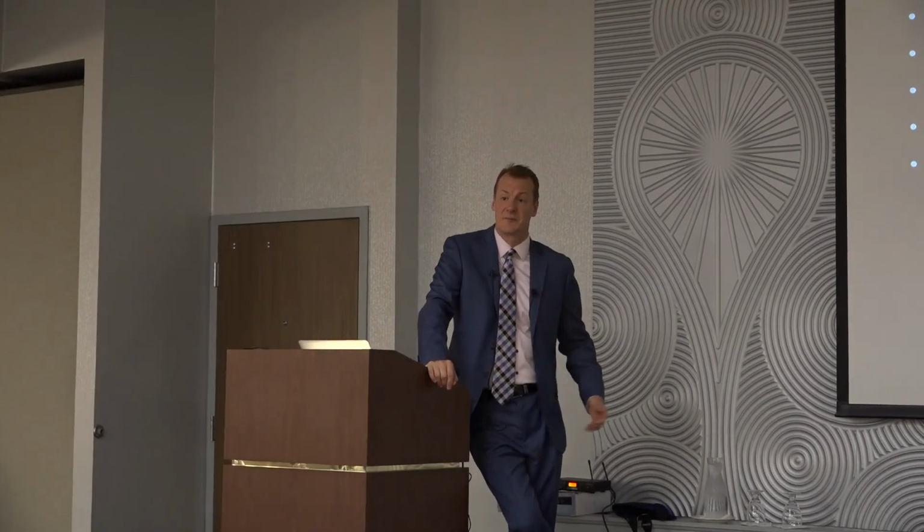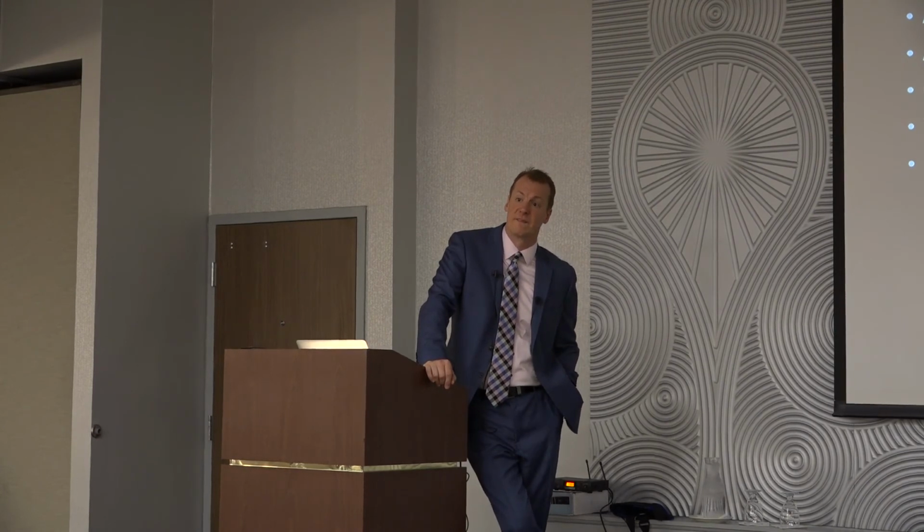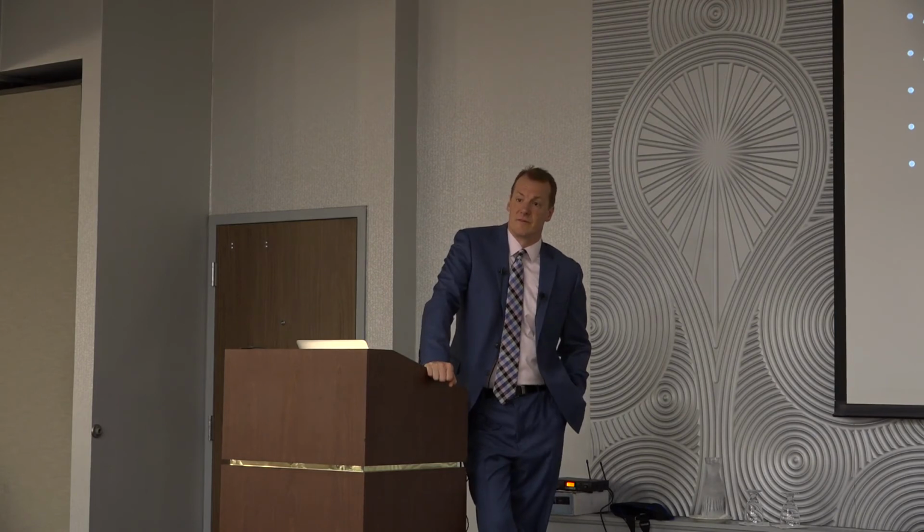Justin. Kevin, you talked about how diaphragm dysfunction leads to worse outcomes. So can you talk about what you're thinking as far as overdriving somebody, how long you would overdrive somebody before you start to worry about diaphragm dysfunction? So by overdriving, we're talking about increasing the ventilator delivery, increasing minute ventilation. And so that could result in a passive patient for a long period of time, and therefore diaphragm atrophy.